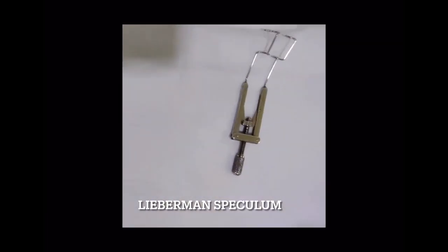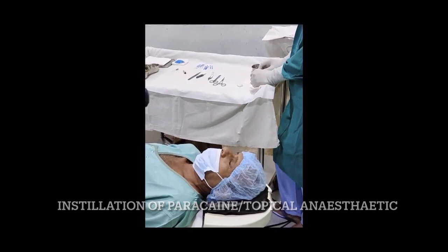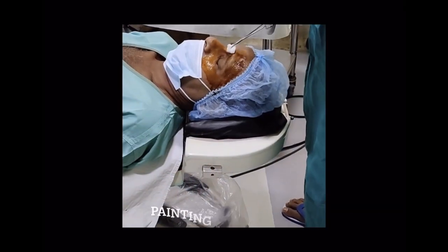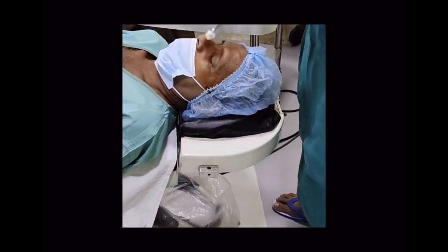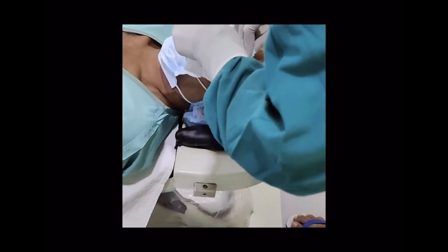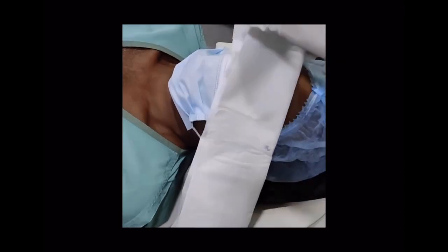A non-traumatic speculum is taken. Here we have taken a Lieberman speculum. So after the patient lies down on the OT table, proparacaine eye drops are instilled in the patient's eye. Gentle painting and draping is done with gentle application of the eye speculum.